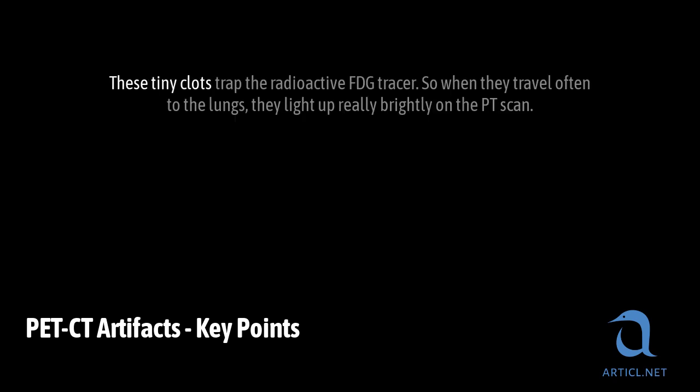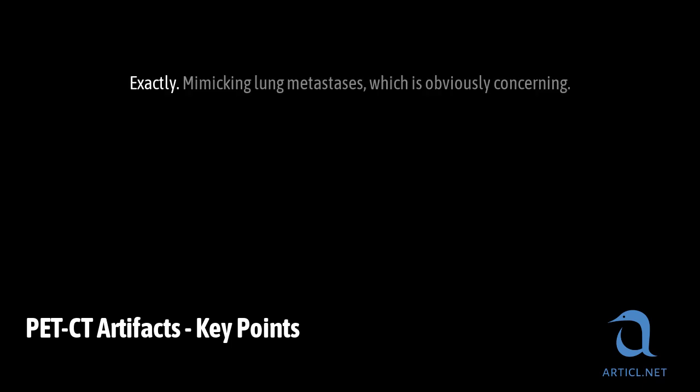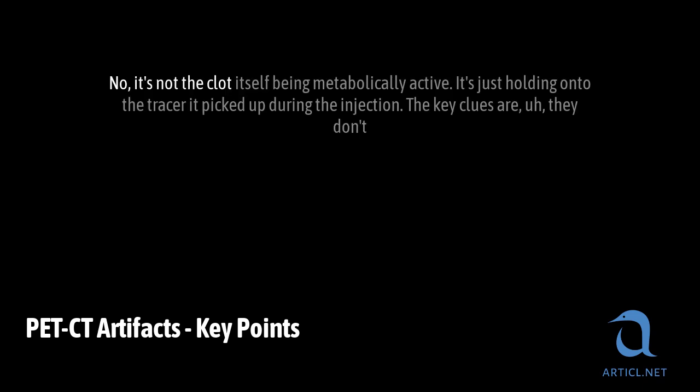These tiny clots trap the radioactive FDG tracer. Oh. So when they travel, often to the lungs, they light up really brightly on the PET scan. Mimicking what cancer spread? Exactly. Mimicking lung metastases, which is obviously concerning. But they're not actually cancerous? No, it's not the clot itself being metabolically active. It's just holding on to the tracer it picked up during the injection.